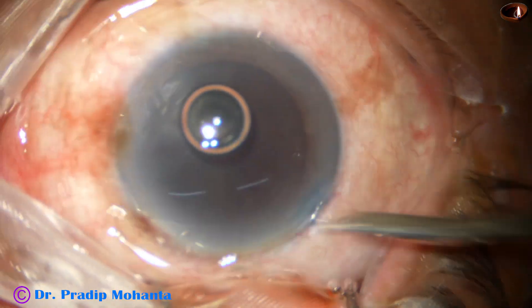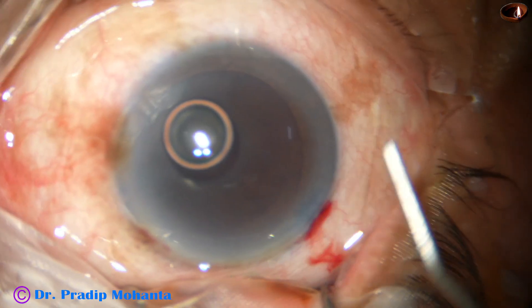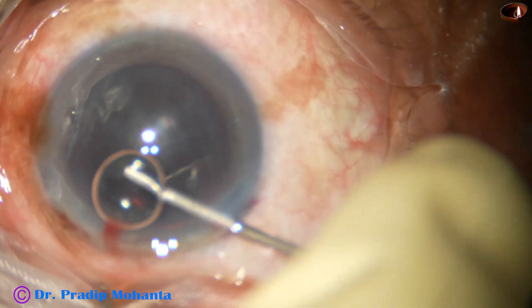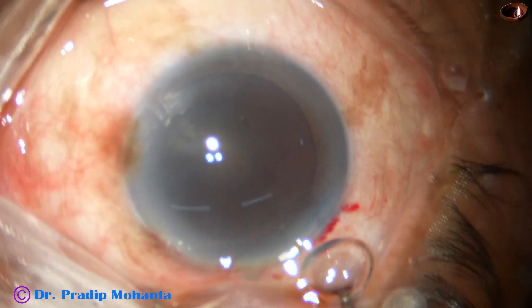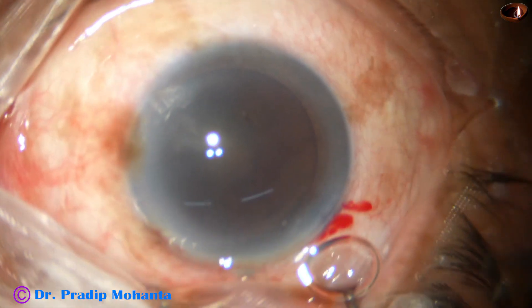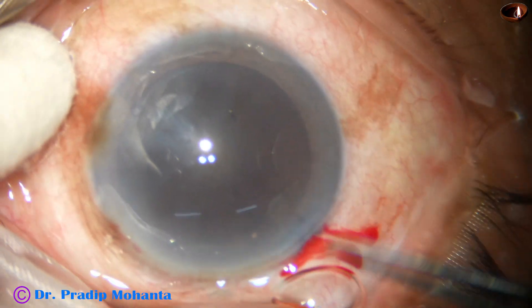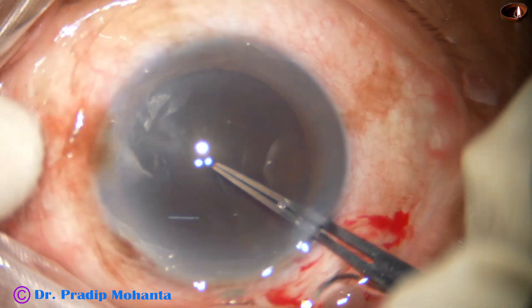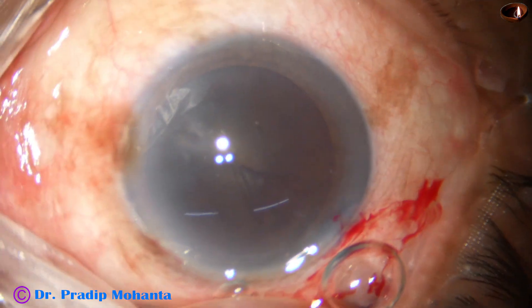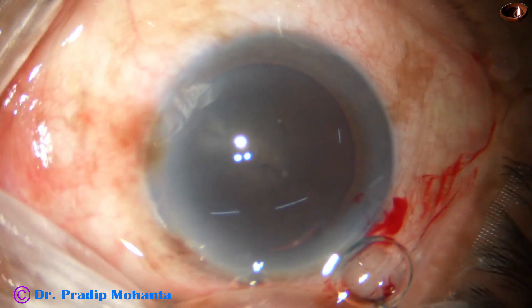The dye is washed out and the anterior chamber is filled up with 2% hydroxypropyl methyl cellulose. Now capsulorhexis. In hard cataracts, do not do a small rexis — do not do a baby size rexis. Do a large rexis. The size of the rexis should be 5.75 to 6.25 millimeters.